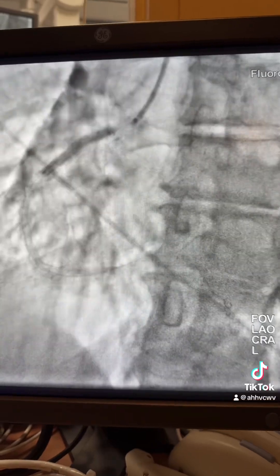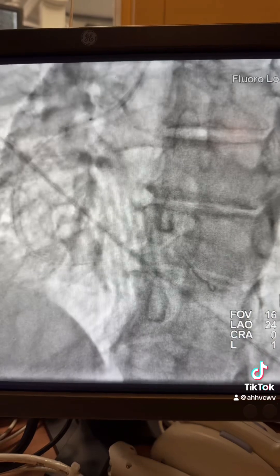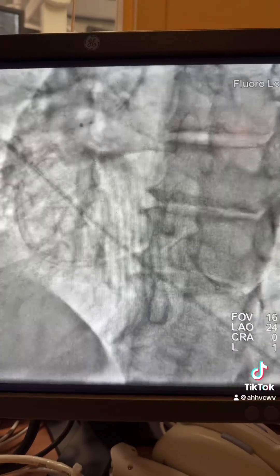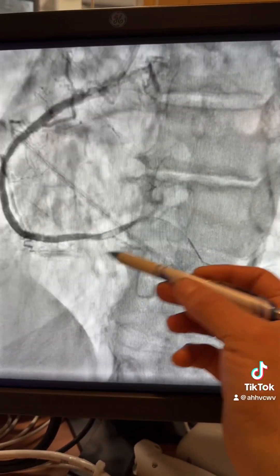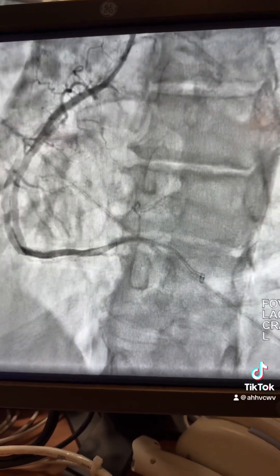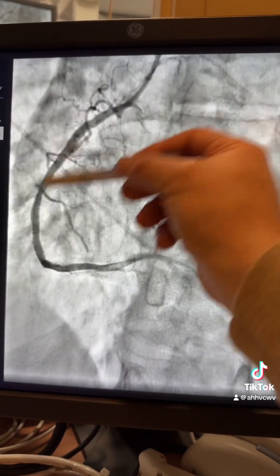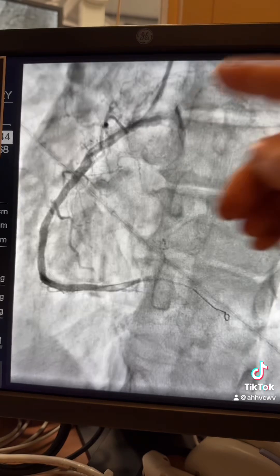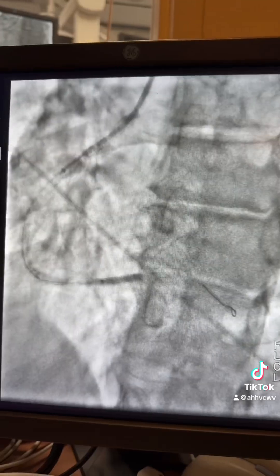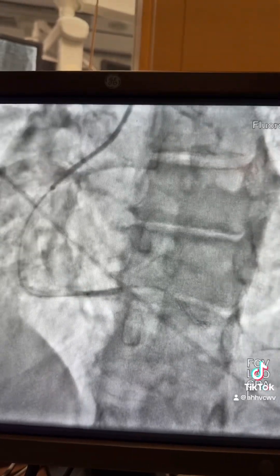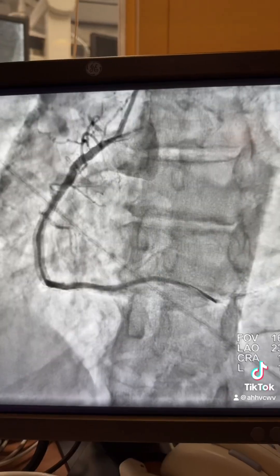All stents are dilated at high pressure up to 18 atmospheres. Before pulling the balloon, always advance the guideliner distally — you swallow the balloon with the guideliner before pulling it out. The angiogram shows there is still a lot of debris or thrombus in the distal segment, so we have to balloon it. With the guideliner already advanced, we can advance another stent distally without it getting stuck in the struts. We advance the distal stent toward the large PL, followed by post-dilation at high pressure. Here is the final result.